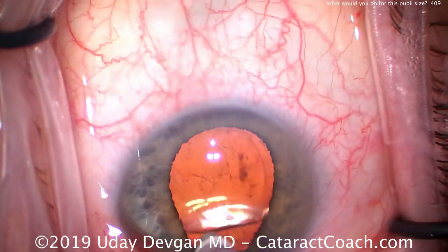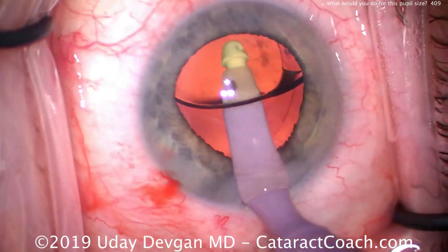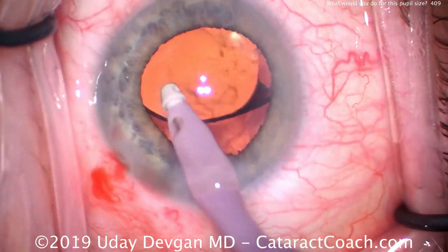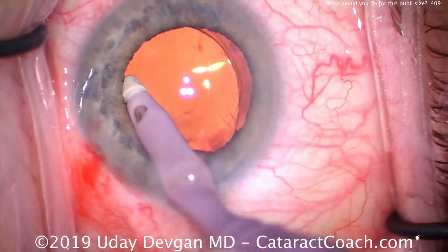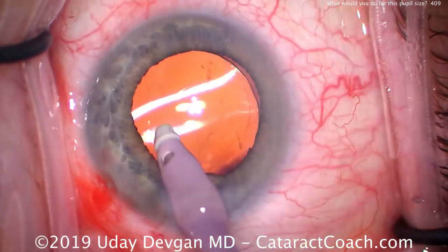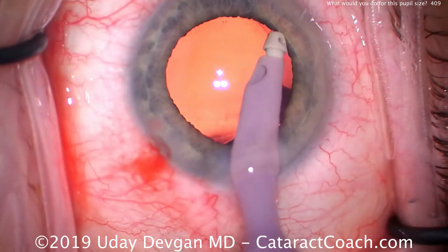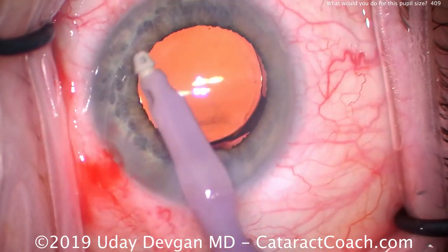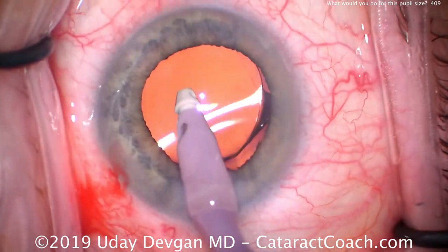With the I/A probe, we go inside and remove all the viscoelastic. Notice again the infusion pressure expands the pupil. We can see quite clearly that there's a good overlap of the edge of the optic by the capsulorhexis, and we can see there's no residual lens material or cortex remaining in the eye — just removing more of the viscoelastic and setting up the lens.